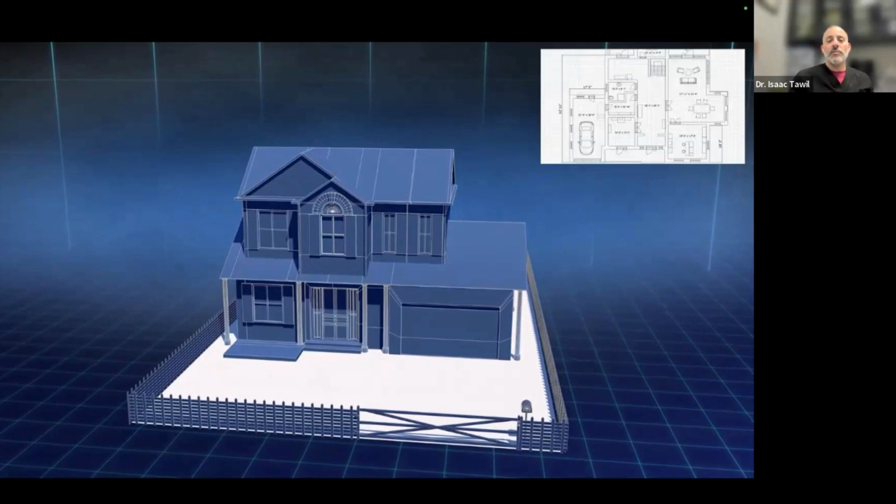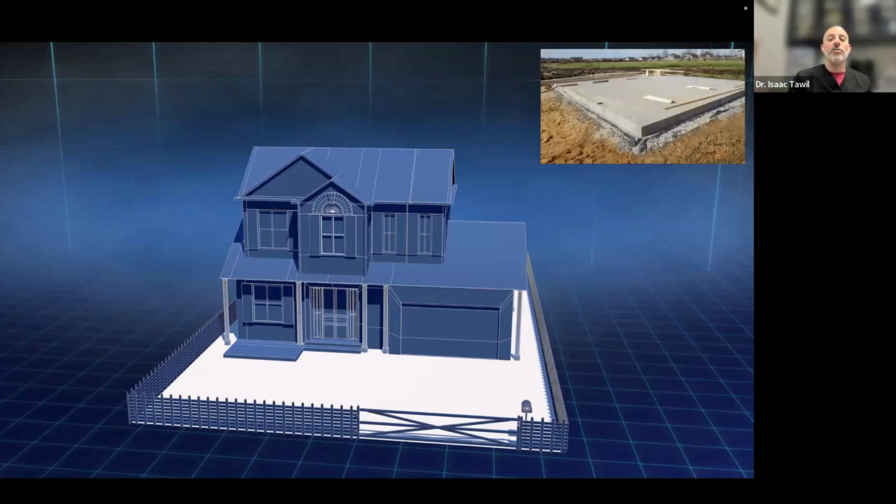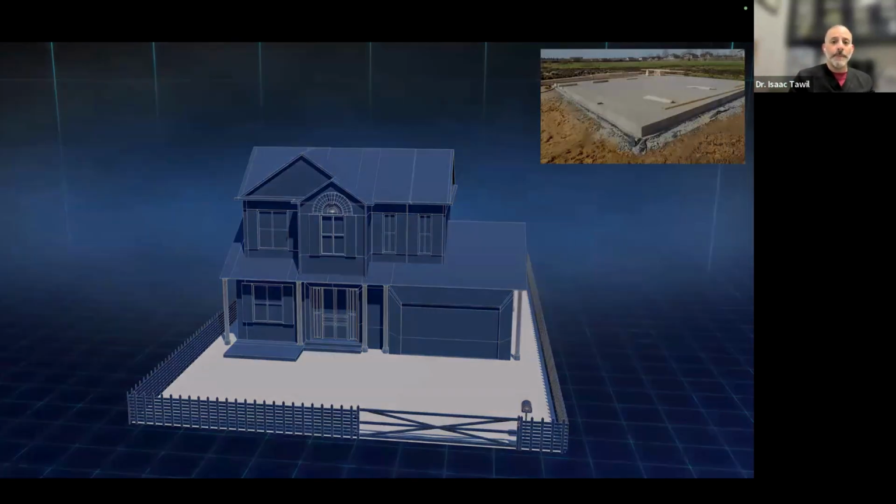Having all the records, so one thing that we need is typical x-rays. CBCT will help us to diagnose the case. But without the rest of the face accompanying that, we are unable to really see the true picture of what it would look like. Just like here, we have the blueprint on the right, we can see the house, we see where the car goes, see where everything is. But it's nice to see a three-dimensional rendering of what the house should look like. And now we can go ahead and treat the case. We can start digging, build our foundation, and move forward.